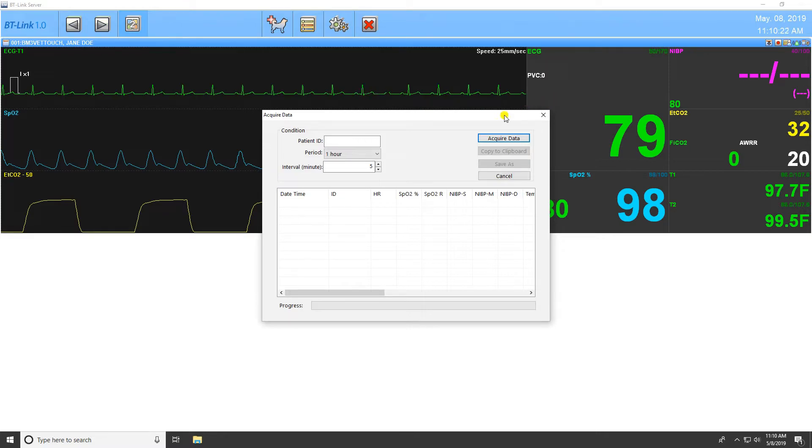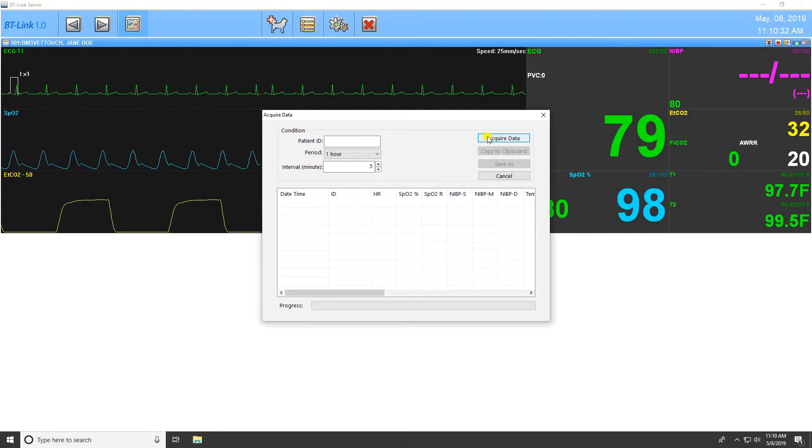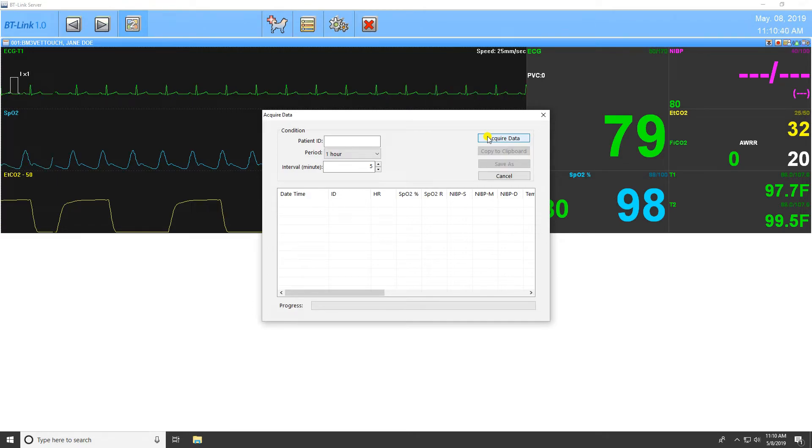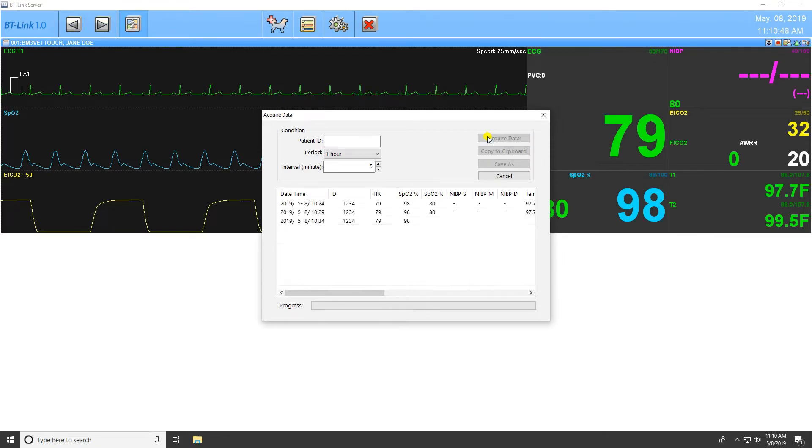This function allows the user to acquire data that is saved in the patient monitor. The Patient ID window is to retrieve data from a specific patient using a previously appointed ID. If this field is left blank, the program will acquire data from all patients. The Period field allows the user to stipulate how far back they would like the data. For example, a setting of one hour will acquire only the last hour's worth of data from the monitor. The Interval allows you to determine the time between data acquisition points.